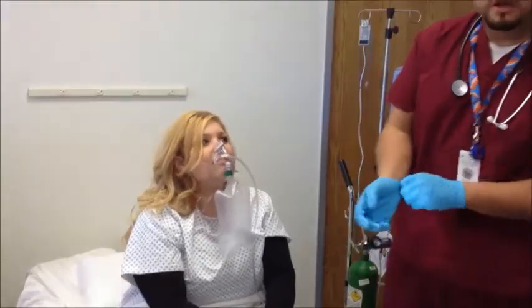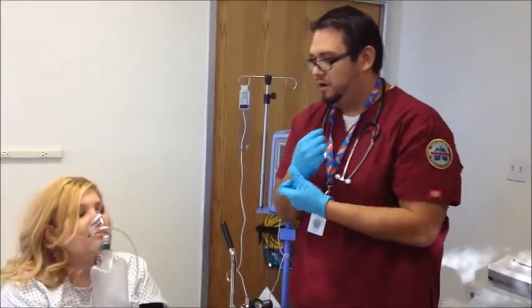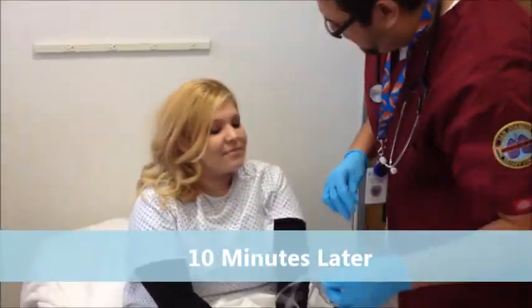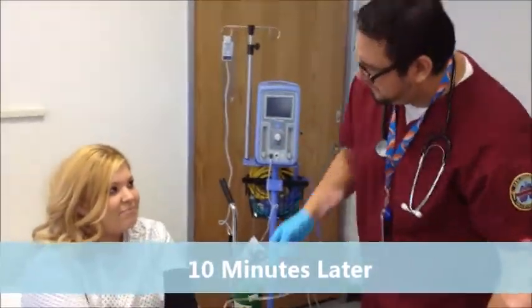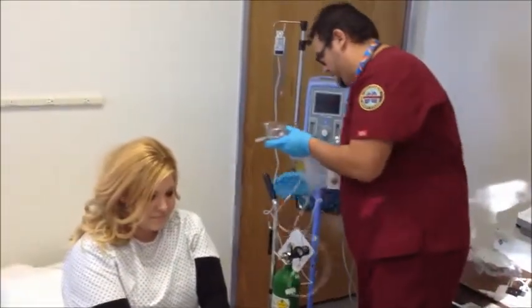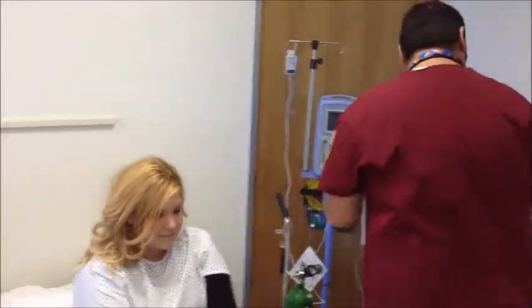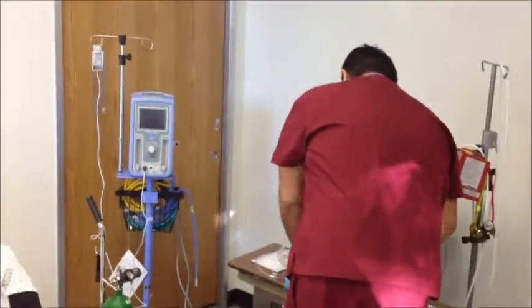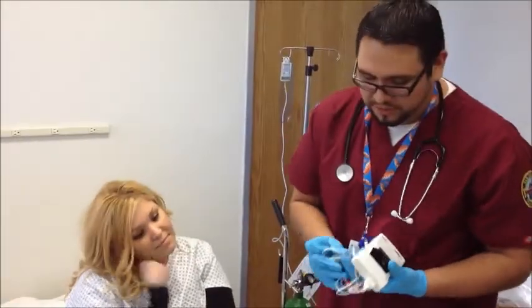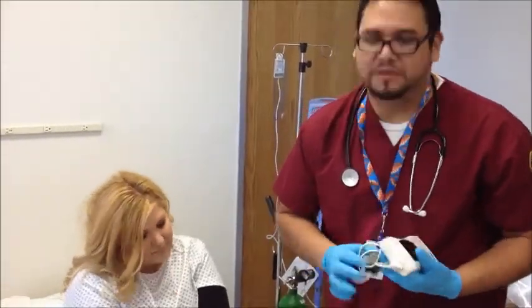I'm going to go ahead and oxygenate the patient for five to ten minutes. Okay, so how are you feeling now? Okay. Feeling a little bit better? Mm-hmm. I'm going to go ahead and check your O2 level again. I'm going to check the patient's O2 stats again to see if that level is resonating.